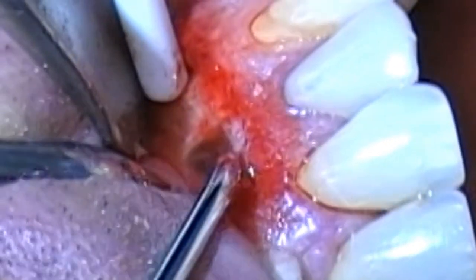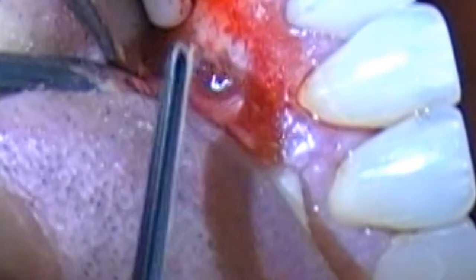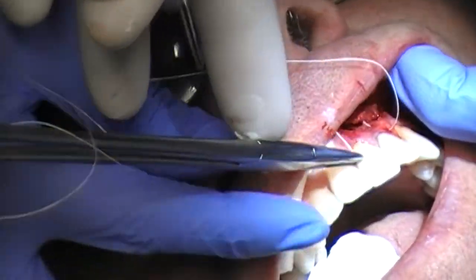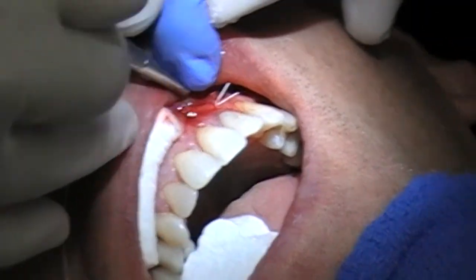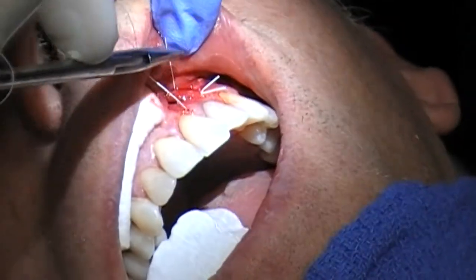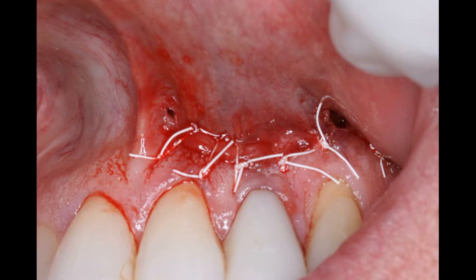In this case you see that we have a sterile piece of gauze that was inserted in order to keep blood from going back into the canal during this whole process. Of course the whole area is gently irrigated and all remaining rests of the bioceramics are removed. We always use ozonated sterile saline during surgeries. Ozone can also be bubbled after irrigation directly into the bone space. If the bone defect is too large, we may also choose to insert PRF or platelet-rich fibrin, which is prepared from the patient's own blood drawn preoperatively.